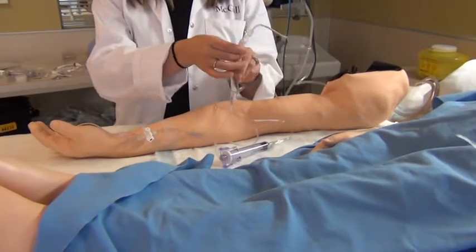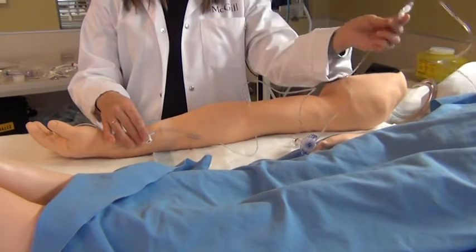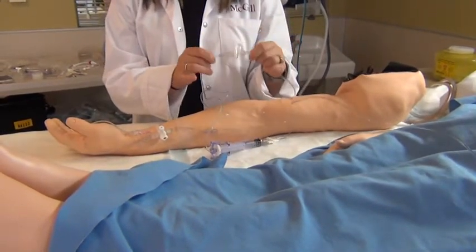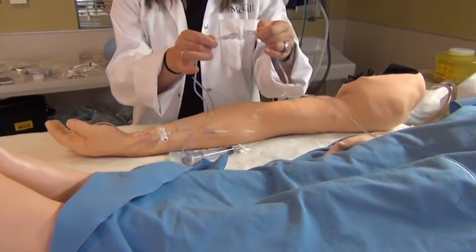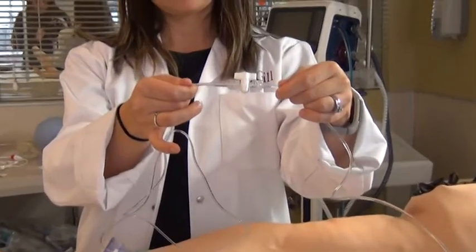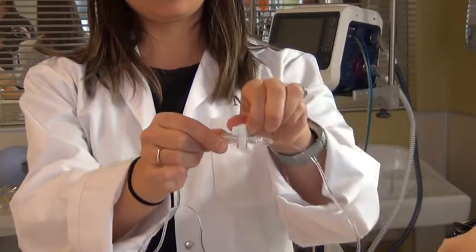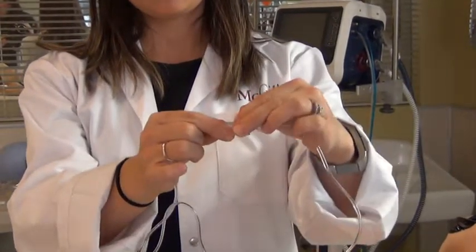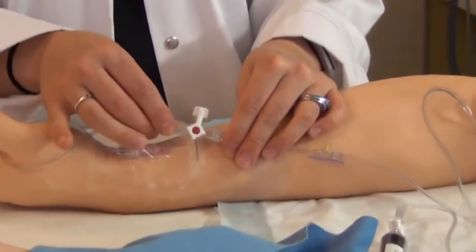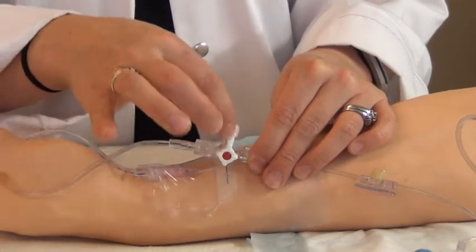Another thing you will notice, there is a number of stopcocks on this line, and you will see why in a second. Bear in mind that there are two different types of stopcock that may be used. There is the two-way stopcock, like so. So it only has an open and closed configuration. And there's a three-way stopcock that allows you to open and close the line in different directions. The only off position is where the little tail is.